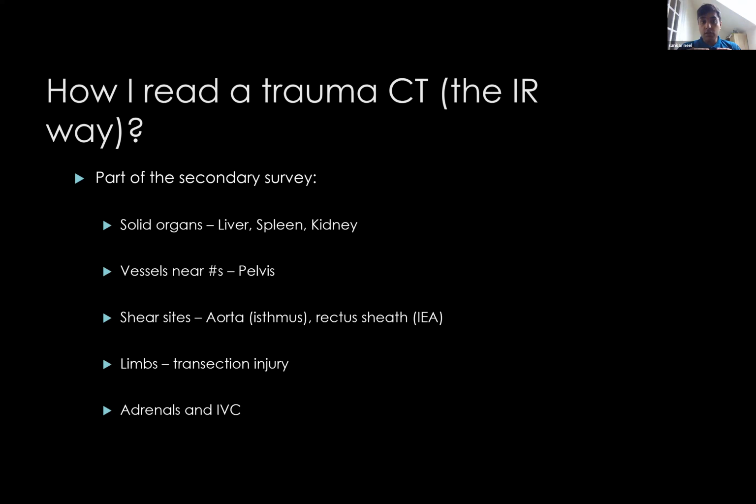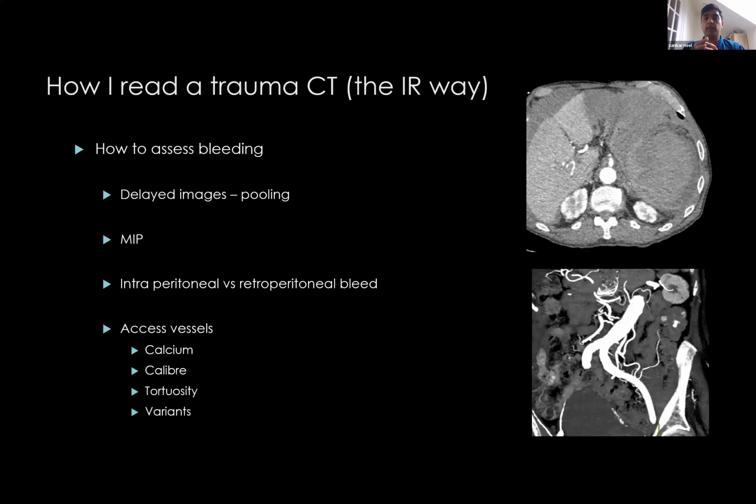An additional clue in the scan would be the adrenals and the IVC. Obviously, if you have streaky adrenals and a flattened IVC, the patient is hypovolemic. The team would know that, but there are some patients that are fluid responders that might not look like this, and they'll be going off a cliff. So it's a good thing to know that these patients need to be rushed into treatment.